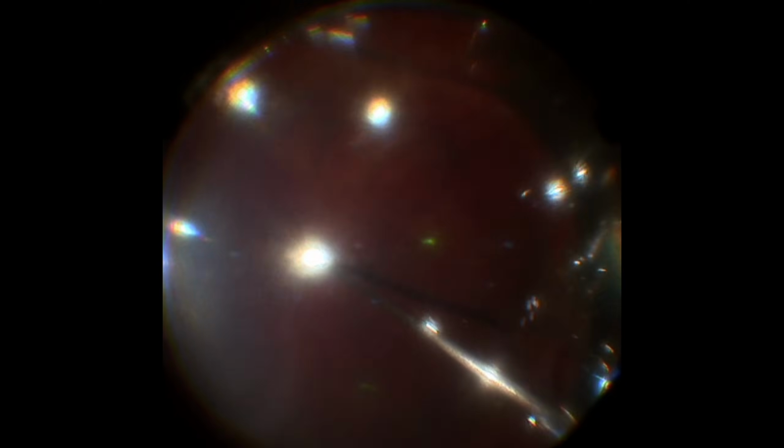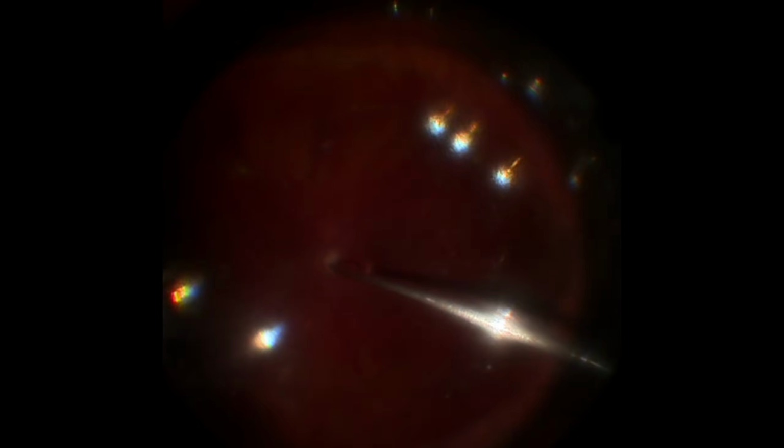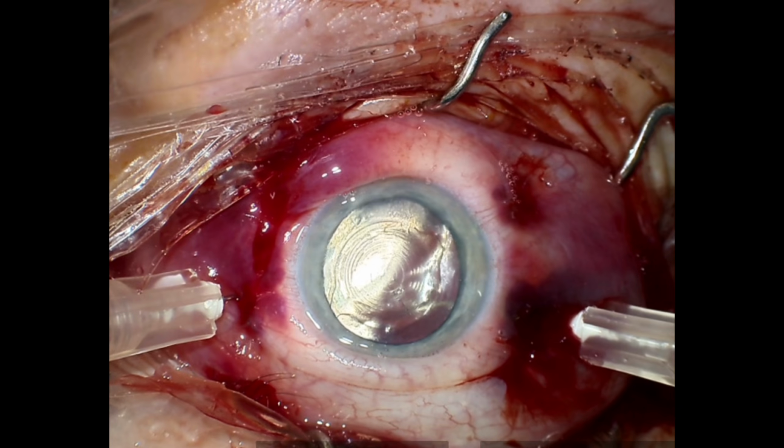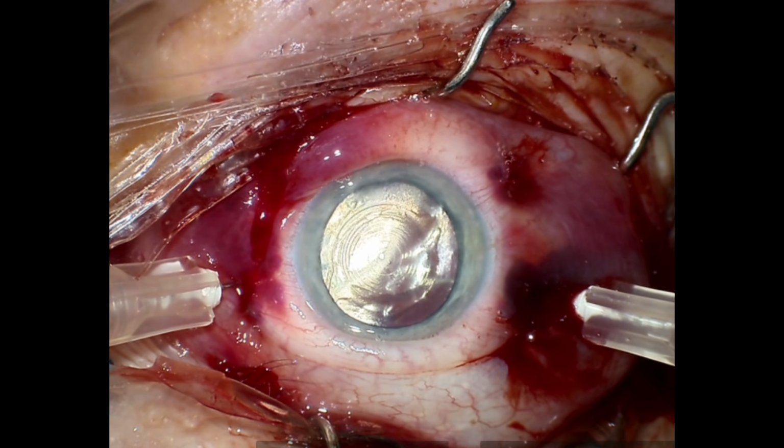In our case, it was relatively easy because only a small amount of subretinal fluid was present. We performed a direct fluid-air exchange, injected gas, and immediately positioned the patient face down to prevent the fluid from detaching the macula. When a larger amount of subretinal fluid is present, it should be drained, either through a drainage retinotomy or externally, especially if vitrectomy is combined with a scleral buckle. We completed the case with an air-gas exchange using 20% SF6.